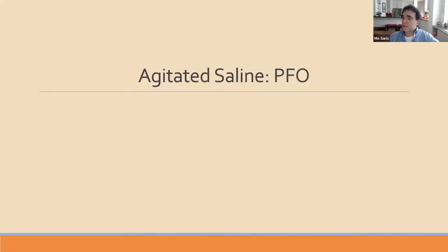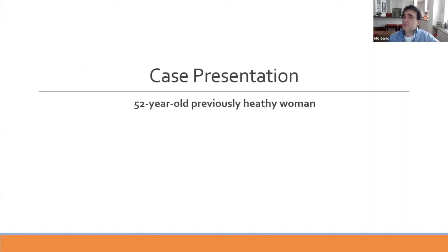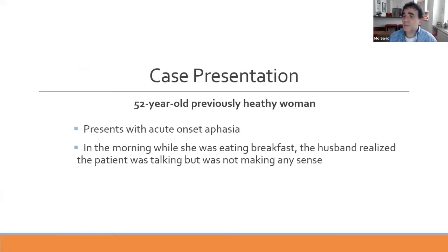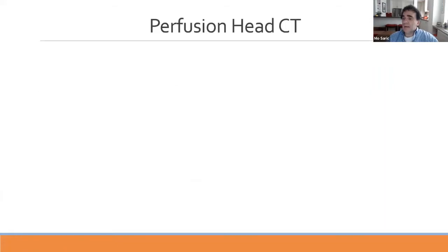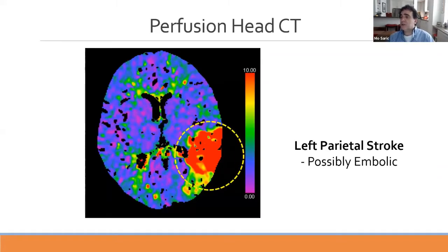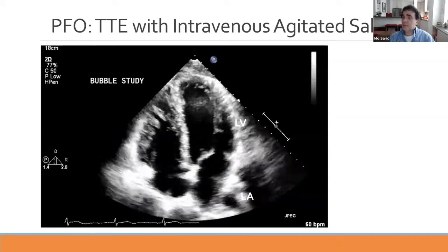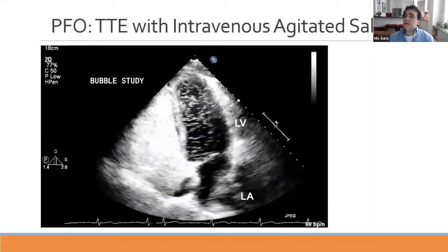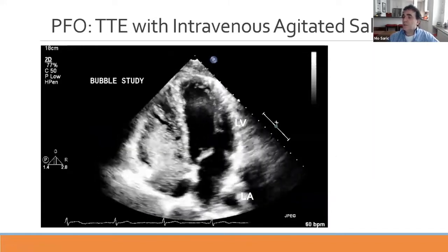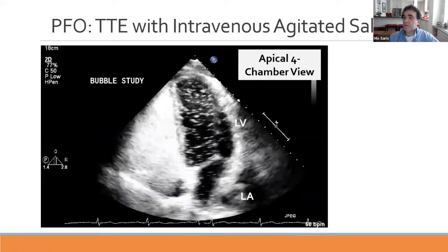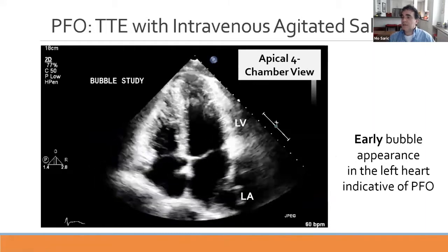Here is a case of agitated saline used to detect a patent foramen ovale: a 52-year-old previously healthy woman presenting with acute onset aphasia. Her husband noticed she was talking but not making sense at breakfast. She was brought to the emergency department, had a head CT showing no bleed, and received a thrombolytic agent. Her perfusion CT shows a large parietal stroke, possibly embolic. Her bubble study shows early appearance of a large number of bubbles in the left heart, consistent with a patent foramen ovale on an apical four-chamber view.